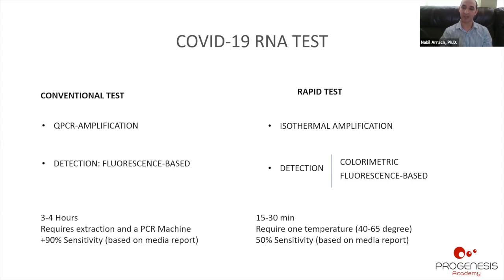But typically, most rapid tests tend to be less sensitive. It's just an inherent limitation that you have to deal with when you are testing. If you want a test that is highly accurate, it will take more time and more equipment, and that's why you're sometimes trading off speed with sensitivity.